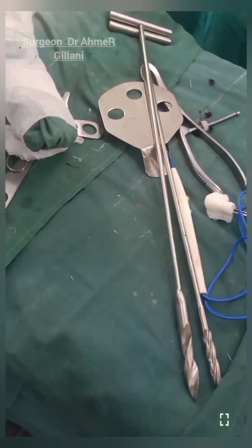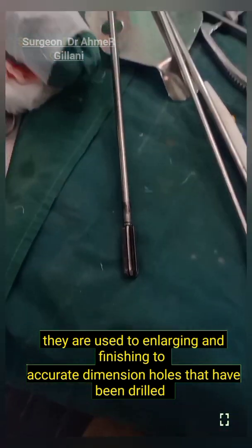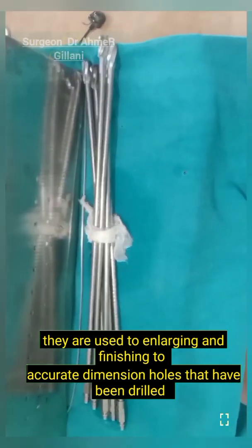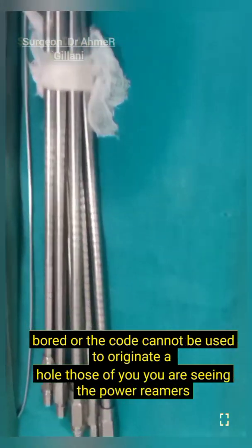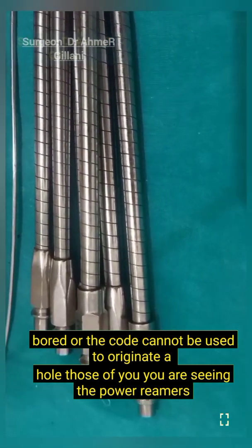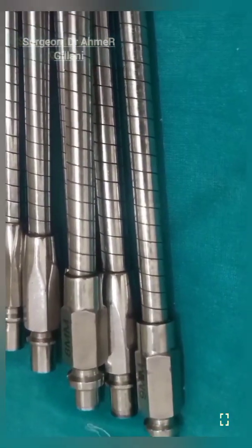These are different types of reamers. Basically they are used for enlarging and finishing to equal-dimension holes that have been drilled, bored, or cored. They cannot be used to originate a hole. In close view you are seeing the power reamers.